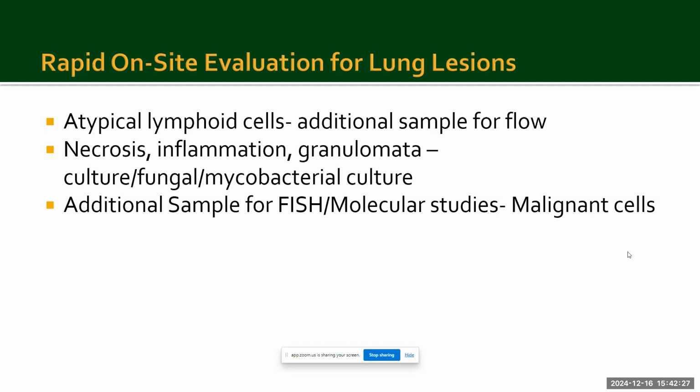Other, if I see necrosis or inflammation or granulomata, though necrosis or even granuloma or inflammatory cells can be seen in both neoplastic and non-neoplastic conditions, I do not hesitate to tell the clinician, hey, can we send for culture? Does the patient have any history of mycobacterial infection, any exposure, any travel? Why don't we send for even fungal and AFB culture? I have a very low threshold of telling them to send anything for culture.